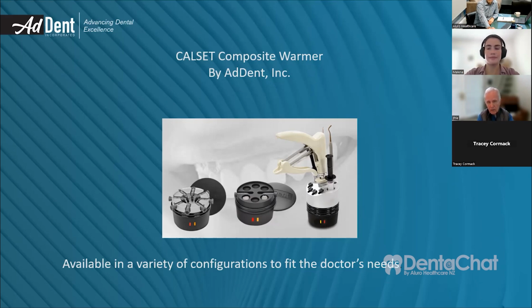onto the facial surface, the material extrudes from all around the margins of the restoration, but it cools very quickly and you can clean it. That doesn't happen when you use room temperature luting cement. It just runs all over the place. And then you have to clean it somehow, and it's not that easy.